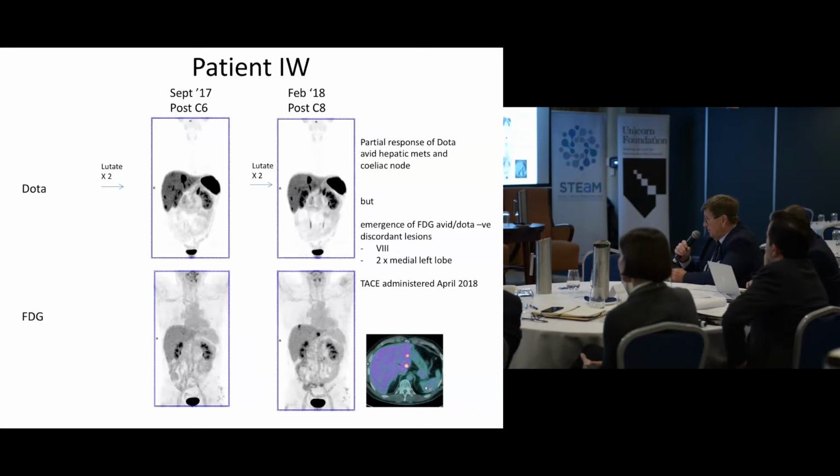I think this is a very important study you are showing now, the value of doing both gallium and FDG PET in the patient, guiding you for the right treatment. So this is good.